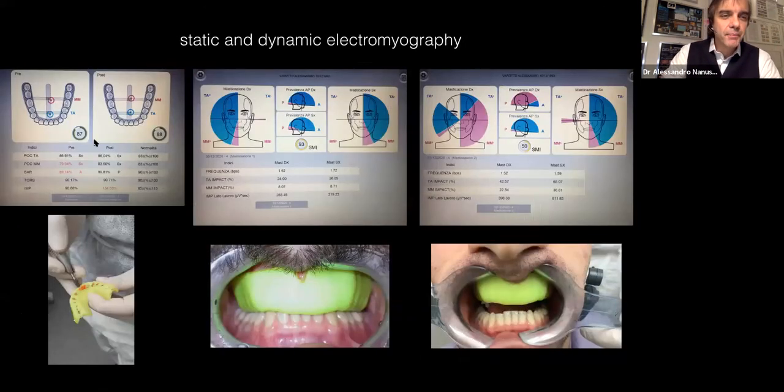But here you can see my mouth guard and the impact is 90%. I need my athlete to use his muscle at the maximal power. This is not maximal power. I have a little inhibition. 90% is not 100%. It's not bad, this mouth guard, but it's not so perfectly comfortable.